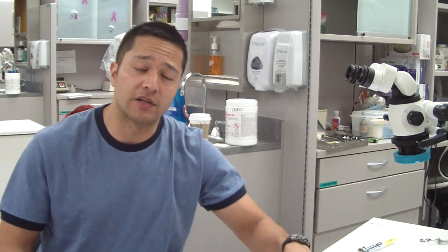Hey folks, Ashley from ThingsEntire.com. What I wanted to show you next is one of the many things I've learned in the last year and a half to do with endodontics. You can see the microscope set up here.